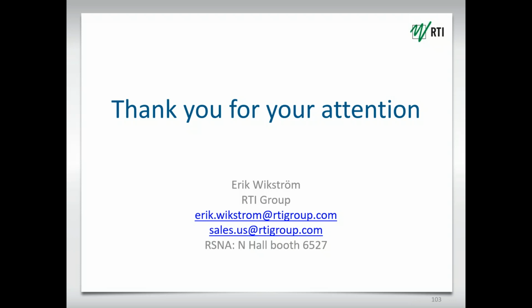Well, the license is actually installed in the meters as such. That means that the license to use the software is associated with the meter itself. So if you're an organization of, say, 5 people and you just have one instrument, you can all download the software on your laptops and share the single instrument that you have.